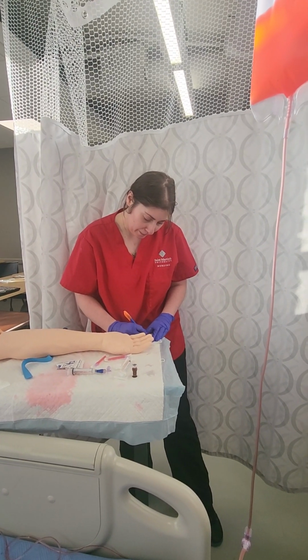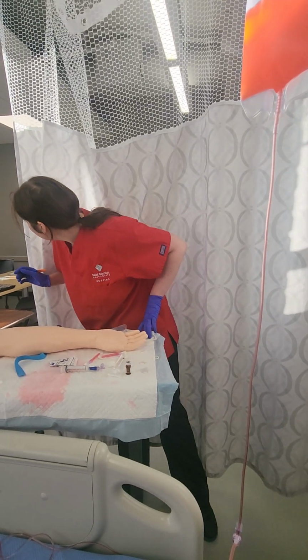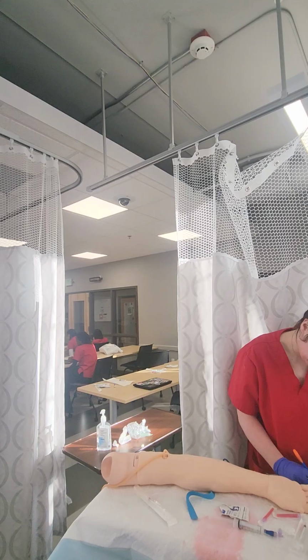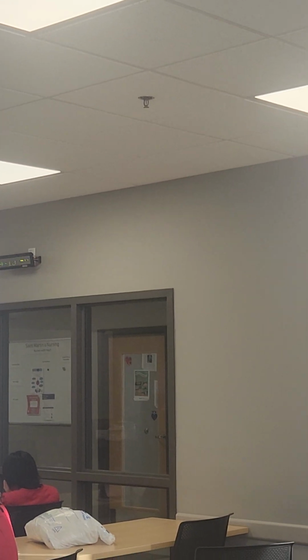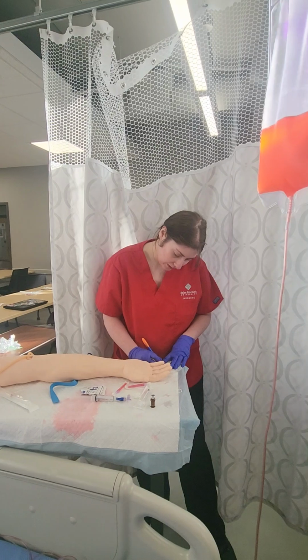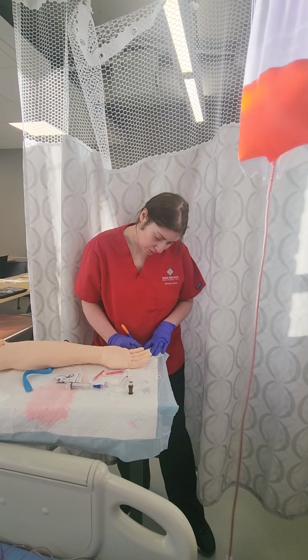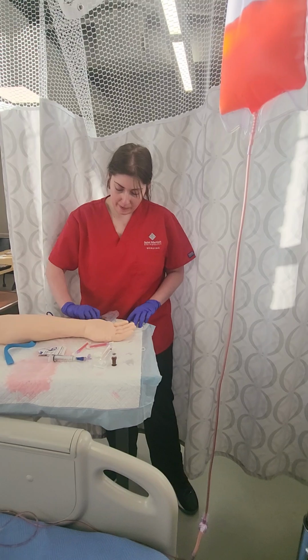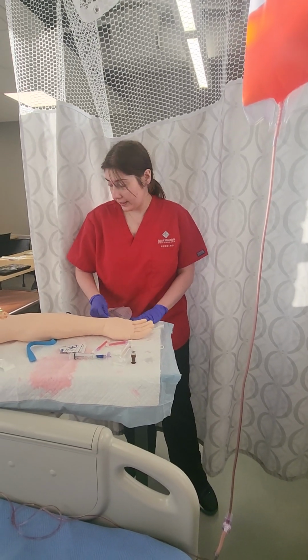It is 16, and it is. So now that is all set.